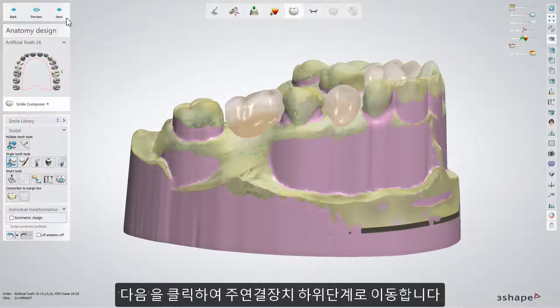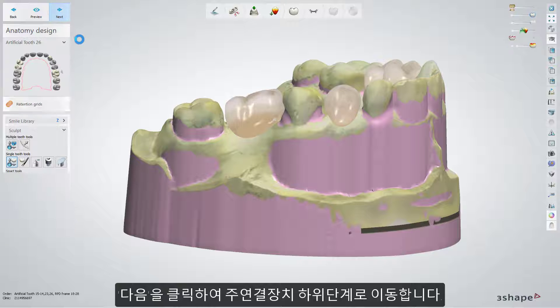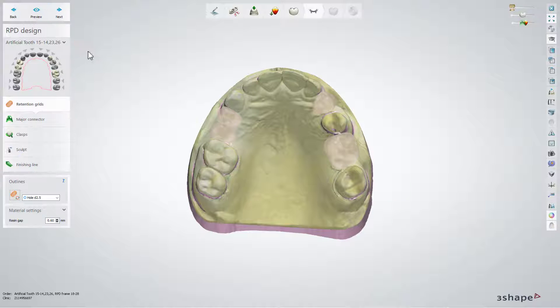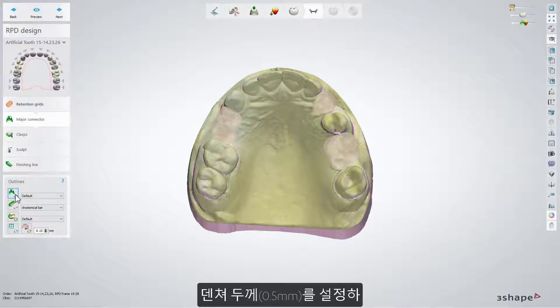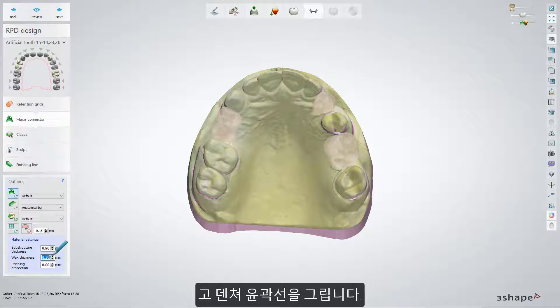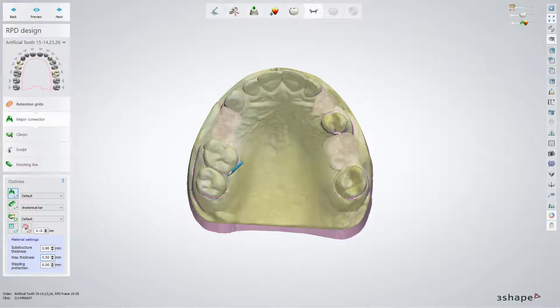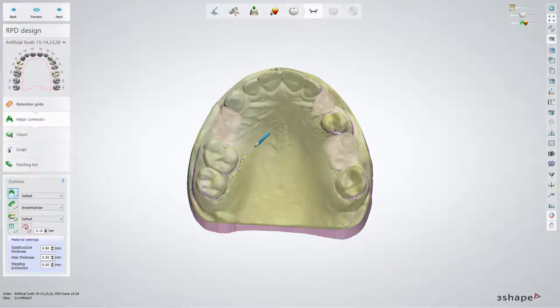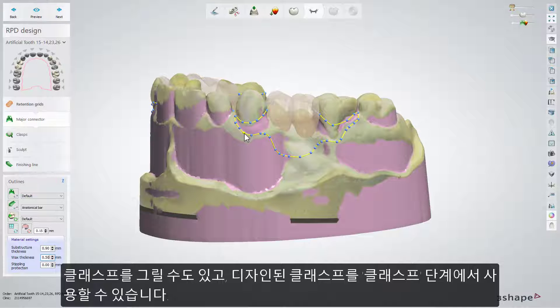Click next to move further and go straight to the major connector sub-step. Set the thickness for the denture and draw the outline for the denture. Draw the clasps as well, or if you prefer the designed ones, use them from the clasp sub-step.